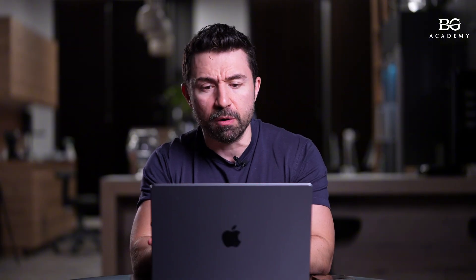What I don't like from the situation is that the anterior teeth have this 8 micron articulating paper sign. I prefer to get stable and tight occlusal contacts on the back teeth — all of them, molars and premolars — and on the front teeth, if I place the articulating paper between them and slide it, it has to slide out lightly. We're speaking about 8 micron articulating paper.